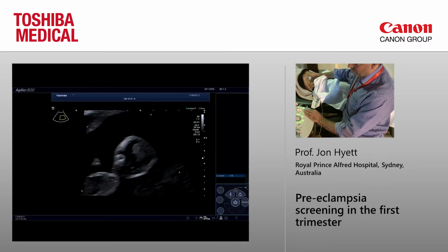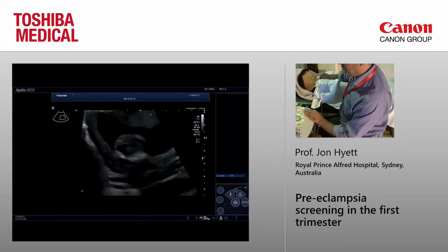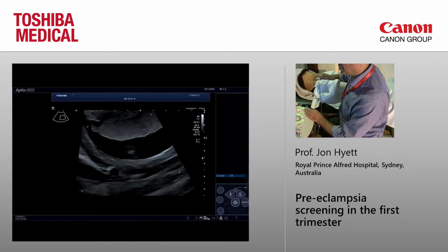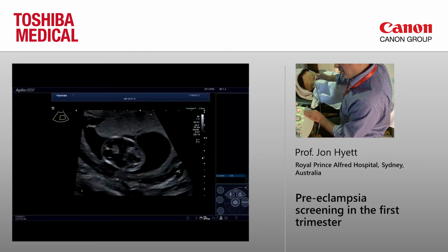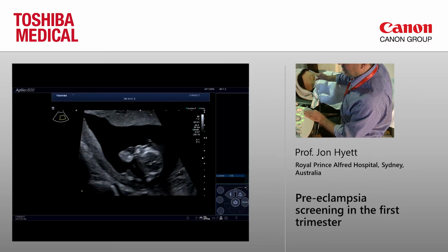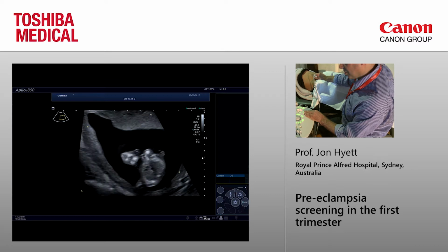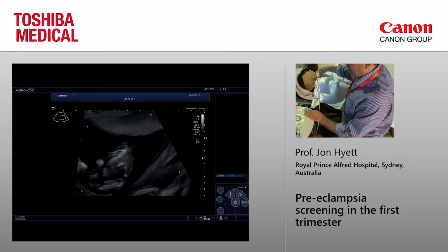Yeah, I'm at a slightly awkward angle to see the nuchal translucency properly. If I just come into a slightly different plane, you can just see the BPD there, you can see the choroids, you can see the falx quite nicely. Just as I come down here, you can see the face quite nicely. You can actually see the mouth, and you can make out in this plane, although it wouldn't be the plane you would use for screening, the two nasal bones. You can also see the lip there.